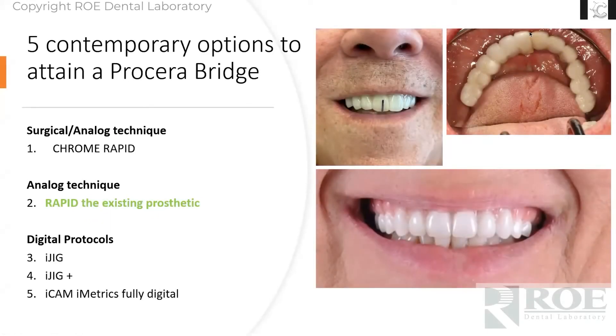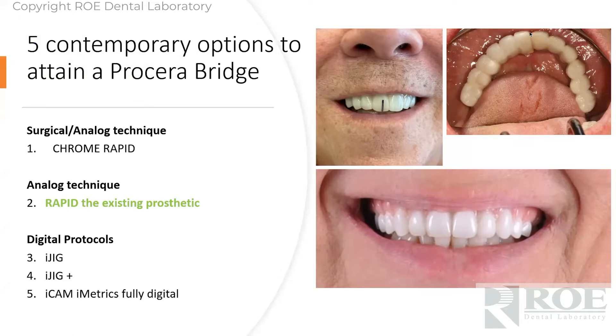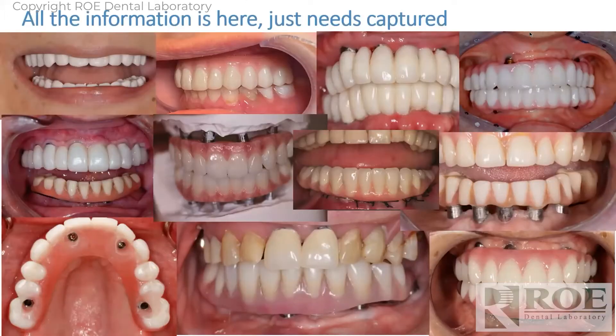The next one is a rapid appliance. The rapid appliance is a different thing — it's either from the surgical side, or we do a rapid delayed method, or a patient walks in with a prosthetic that needs to be redone. You can see these images here — look how far the midline is off. The patient has a gummy smile. On the lower one it's an FP1, on the upper. It works best at the MUA level. Patients come in with really just about any situation you come across. I took all these pictures — full disclosure, almost all are from the internet — just to give an idea of what comes into the office and what you can do with it.